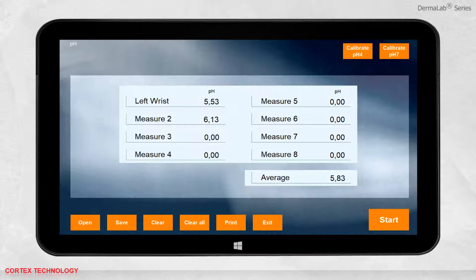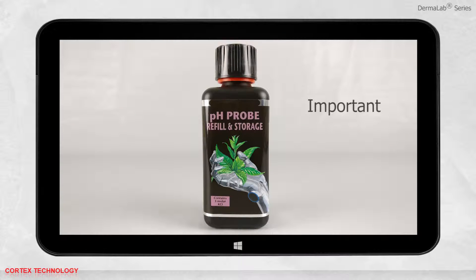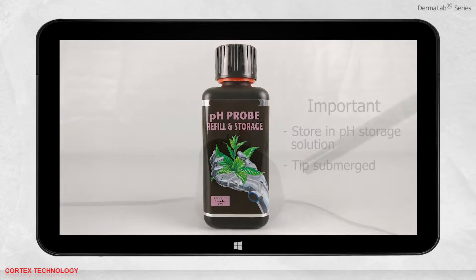When you are done using the probe, it is important to store it correctly in the pH storage solution. Submerge the probe tip in the storage buffer, which comes with the probe.